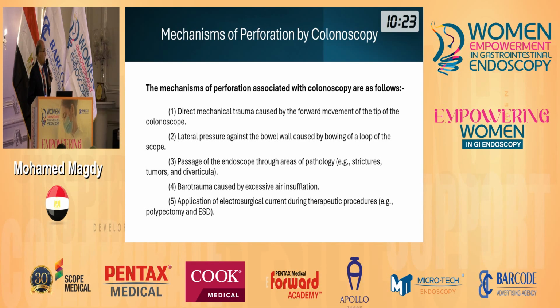There are different mechanisms for perforation. First of all, with the tip of the colonoscope: when we push against resistance, we can perforate the gut with the tip.